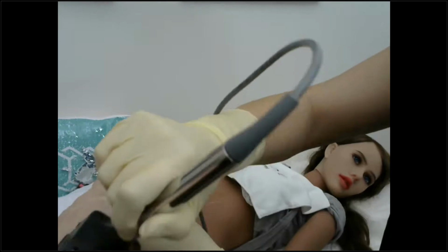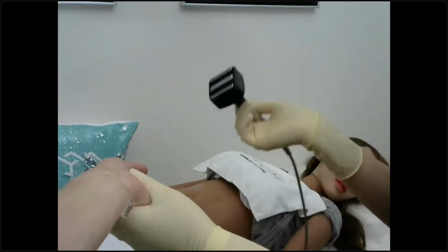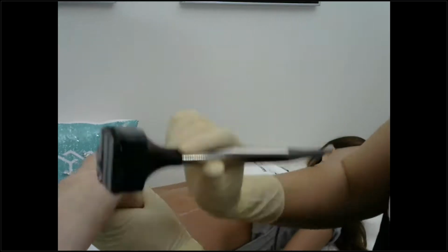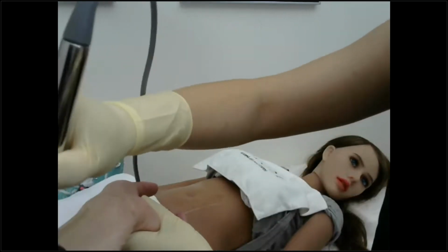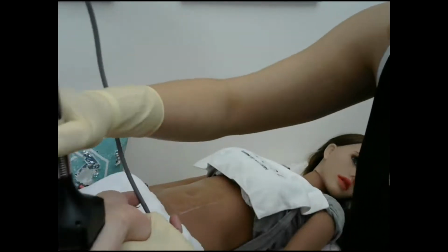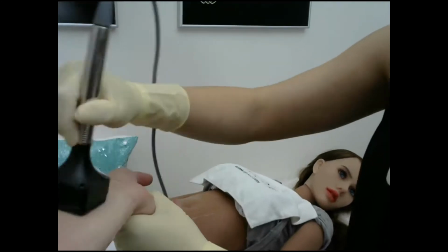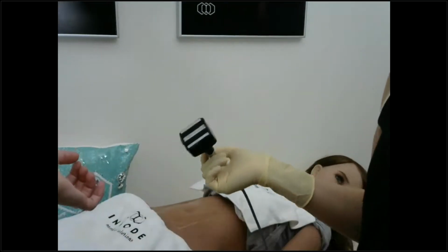Now, what happens if I accidentally lose contact with the skin? Okay, so this is a good demonstration. What I want to make sure is that if I have to stop the treatment, and this is true for face and body treatment, I first, while moving the handpiece, remove my foot off the foot switch, and then I remove the handpiece. So this is the idea.